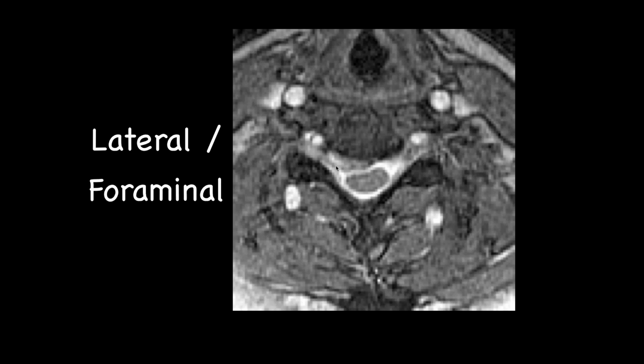Yeah. I'm sorry, I'm just harping on this thing. I wondered, could you just do away then with the straight sagittal, or maybe just to get an alignment one, just do one quick shot through the sagittal, and then use the obliques instead?